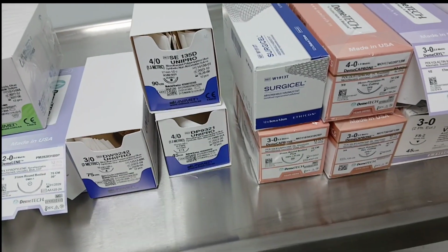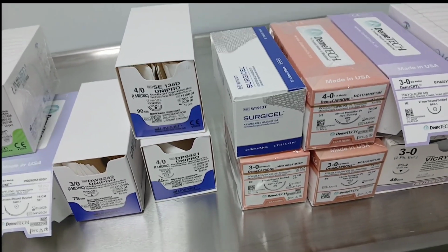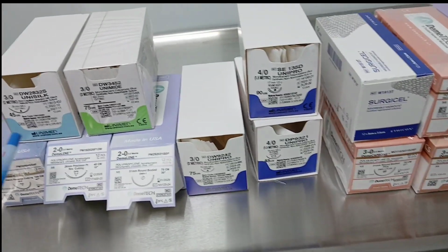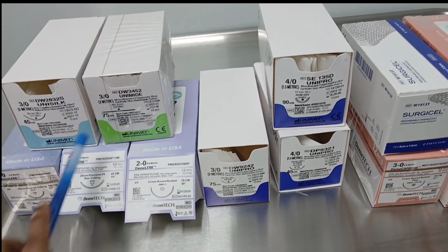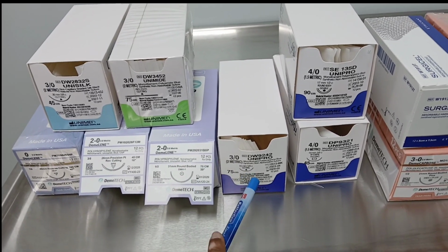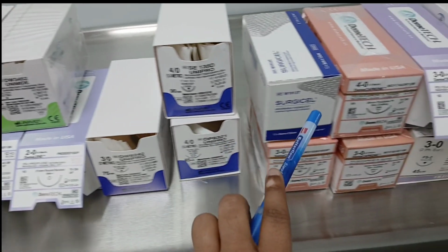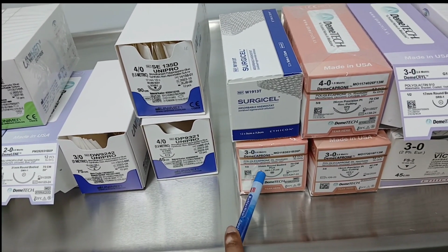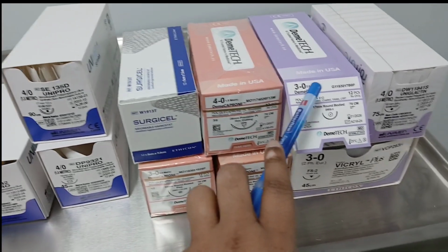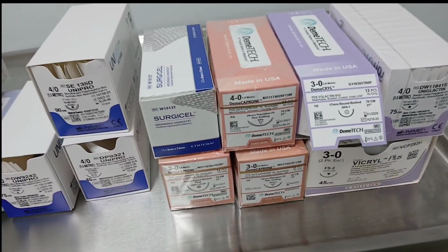In the OR we have many sutures. Just for explanation purposes I am keeping a very small amount of suture here for the basic information. So again I will tell: 3-0 silk, ethilon, 0 prolene, 2-0 prolene, 3-0 prolene, 4-0 prolene, surgicel, 3-0 monocryl, 4-0 monocryl, 3-0 vicryl and 4-0 vicryl.